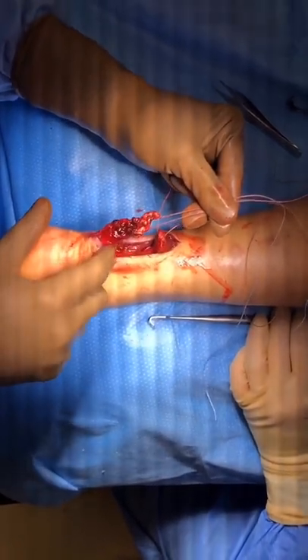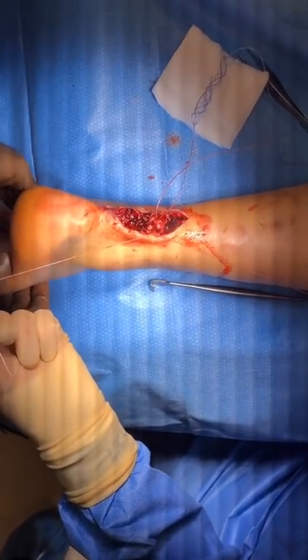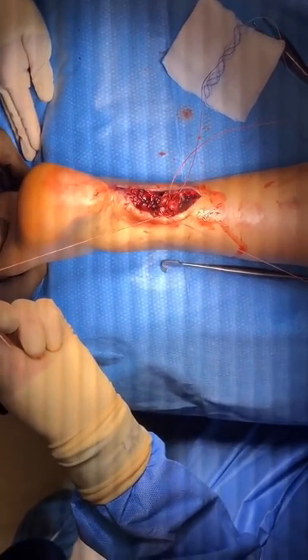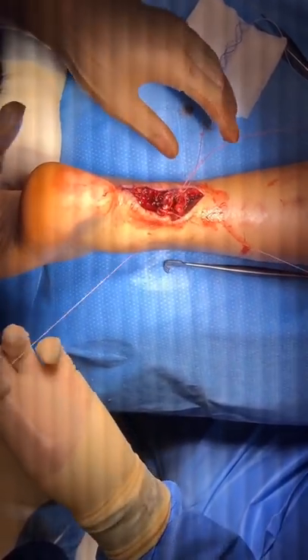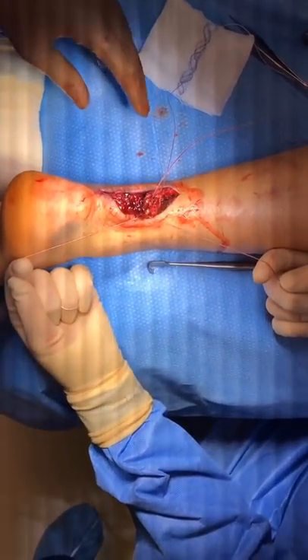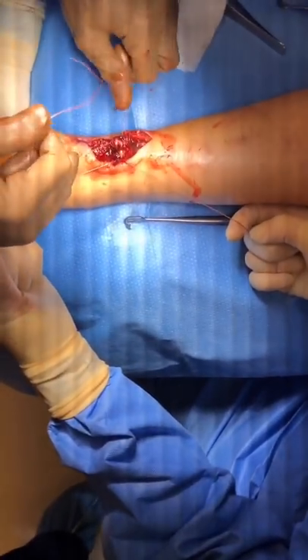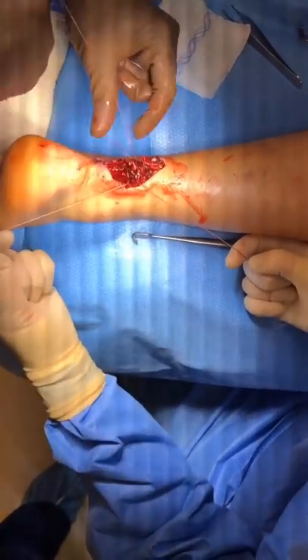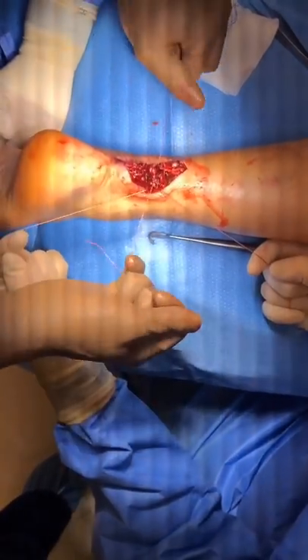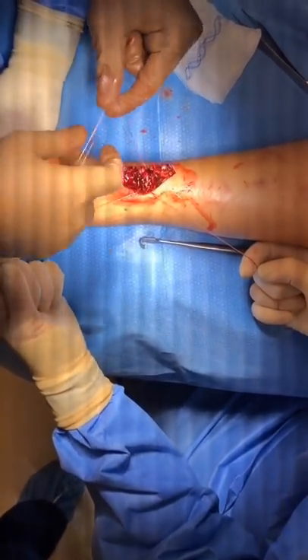Now we have the Krakow stitch in the distal segment. We will simply tie these two together, and we always put the ankle in slight plantar flexion — what we call physiologic plantar flexion — and then tie the limbs. I don't like putting it too far down because that over-tightens the Achilles; we really just want to restore the physiologic tension of the Achilles. My assistant will approximate the other two ends.